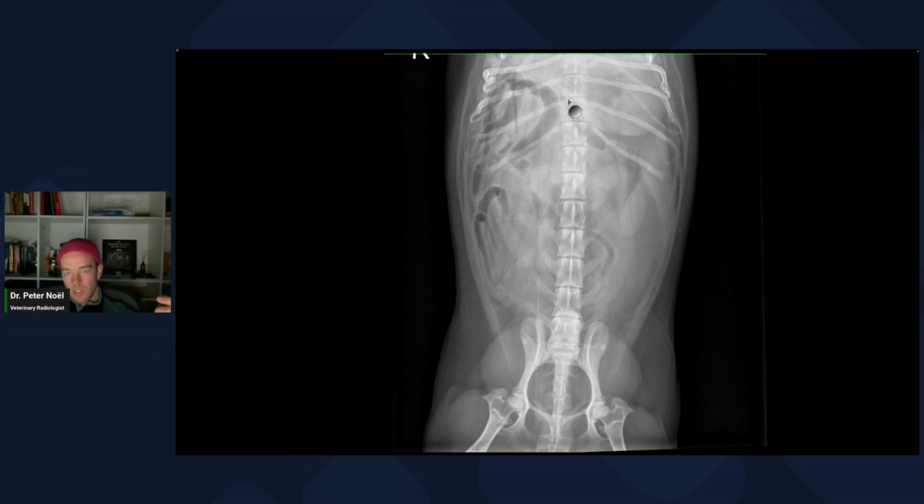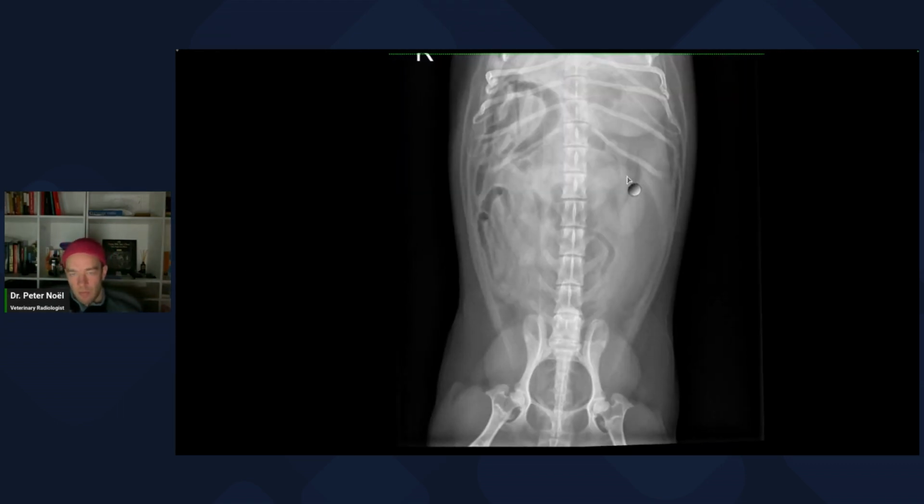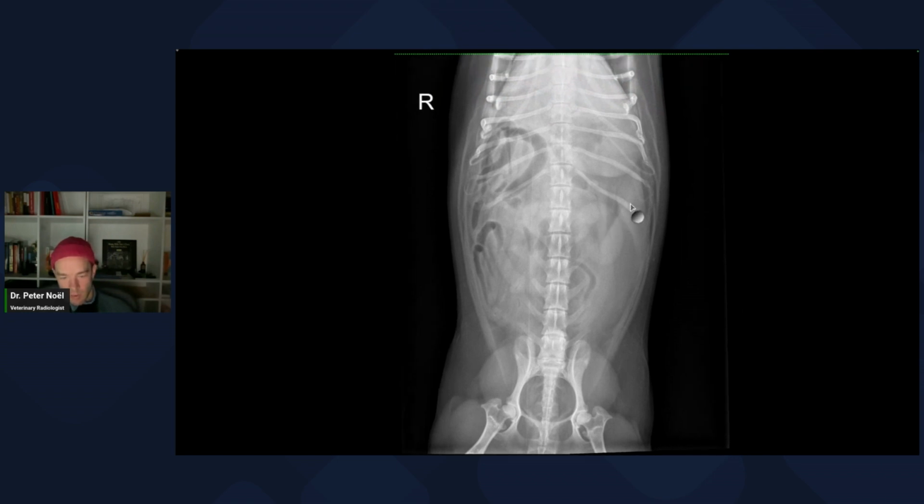This is only really important for surgeons sometimes. If this dog, once his back, there it is right there, 13, 12, 11, 11, 12, there's that mineralized disc. Once his back blows on him, it's important that the surgeon know that he's got symmetric ribs and the number of lumbar vertebrae that he has and so on.